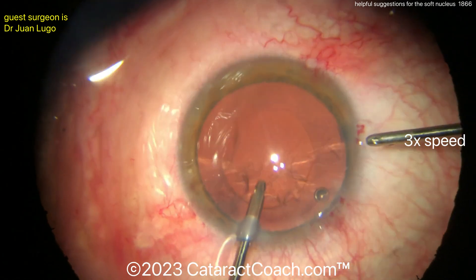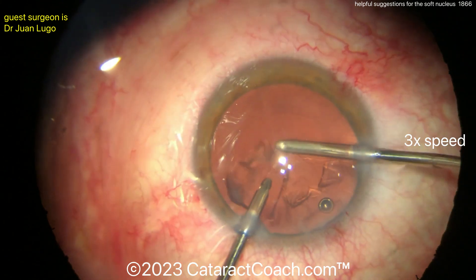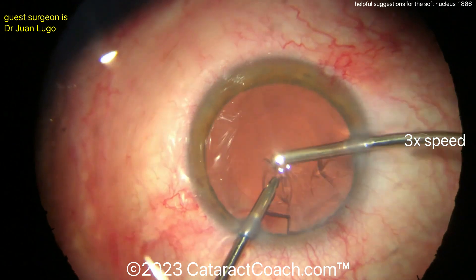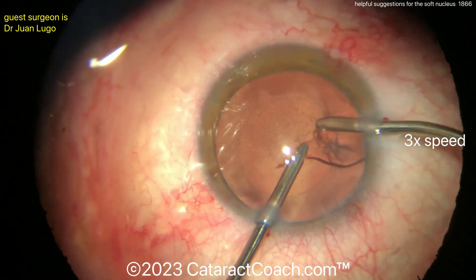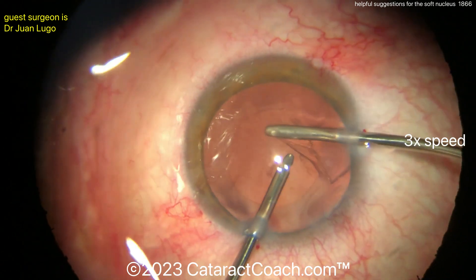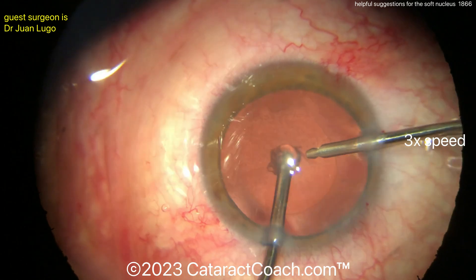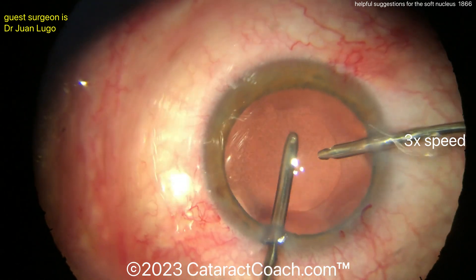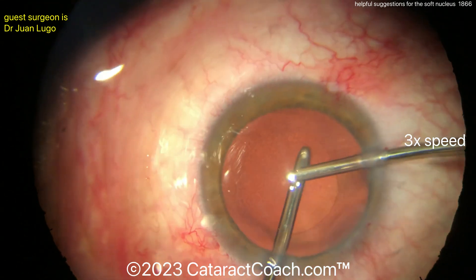Now I see why we've got the bimanual going on — that looks nice, it's going to give great access 360 degrees. So removing the cortex here, very nicely done. And if you need to, you can certainly switch hands to get the remaining cortex, then clean up the capsule bag very nicely. There's the hand switch — infusion now on the right, aspirator on the left. That's cleaned up very well. Be cautious of that posterior capsule.